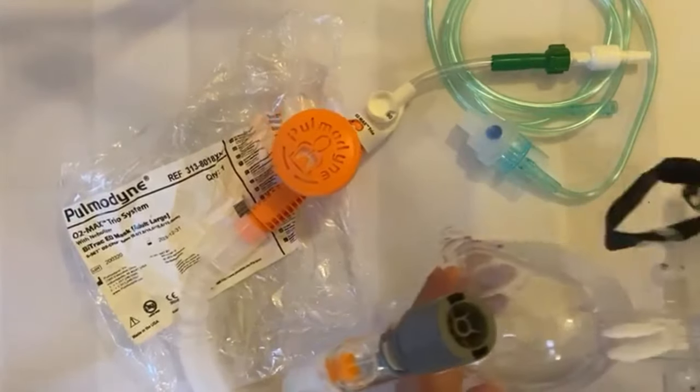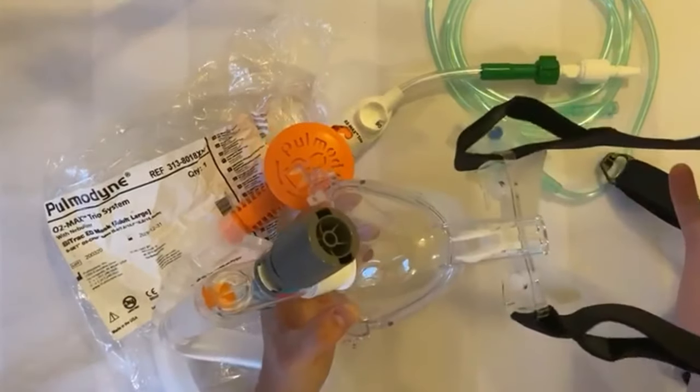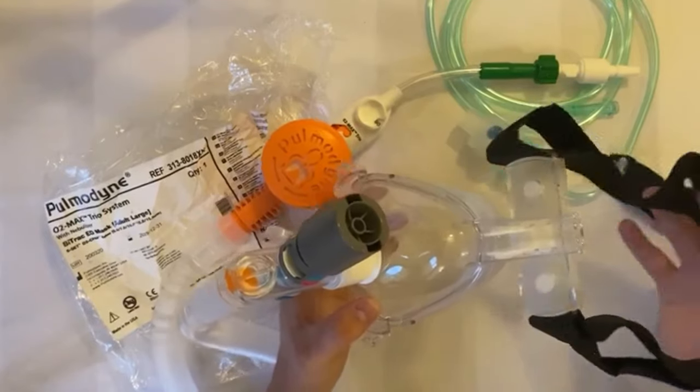Have one member of staff hold the mask to the patient's face, allowing them to take a few breaths before another staff member adjusts and fits the mask. This has been shown to increase the patient's tolerance to the therapy.